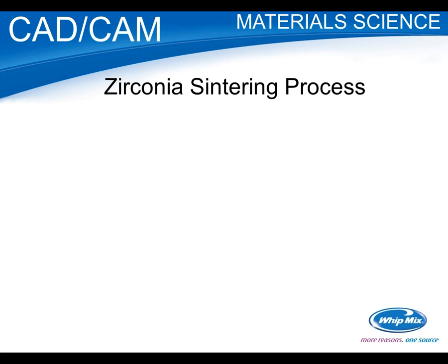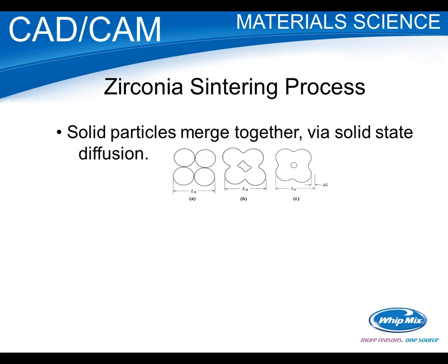The other thing I'd mentioned earlier, the big thing that's under your control, is the sintering process. So just to go over what's happening. If this were porcelain, what we would see are crystalline particles that, as we heat up, merge and melt together into an amorphous matrix. Well, that's not the case with zirconia. These are the particles, and within these particles are zirconia crystallites. And they're already in the stabilized tetragonal form. When you heat it, you are not converting it from the monoclinic to the tetragonal. It's already in the tetragonal form. The powder manufacturer doped it and got it into that form.